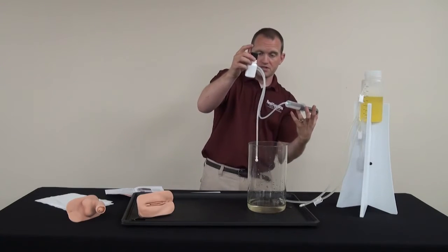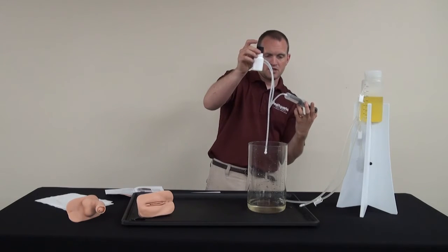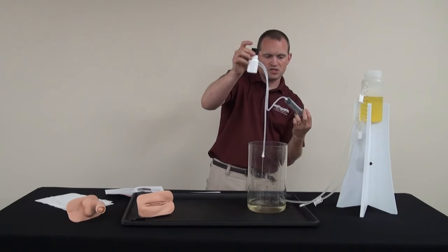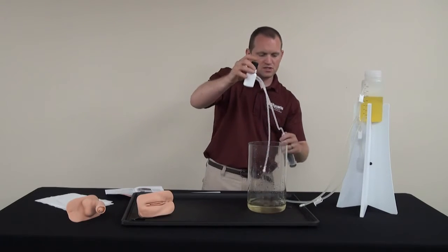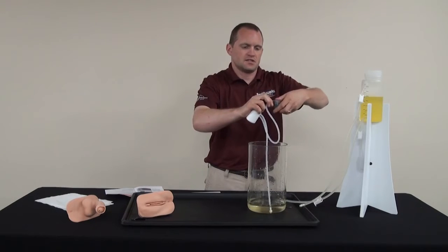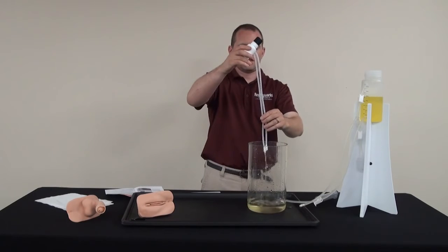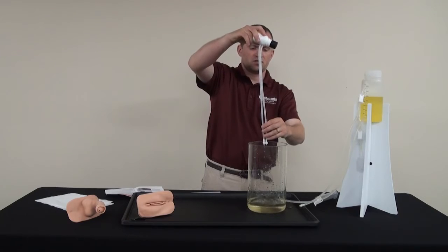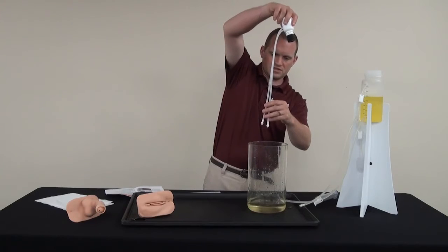Make sure this bladder is held upright, the black cap is pointed upward, and then squeeze the contents of the syringe through and into the bladder. You can go ahead and disconnect the syringe, and to empty it, just tip the bladder up and over to dispel the rest of the liquid.